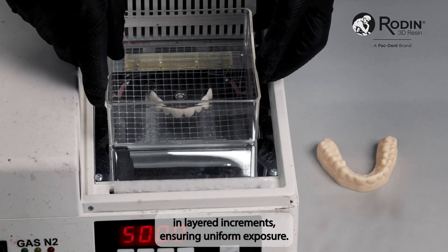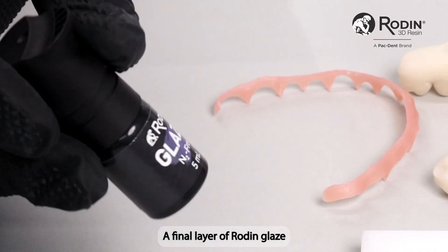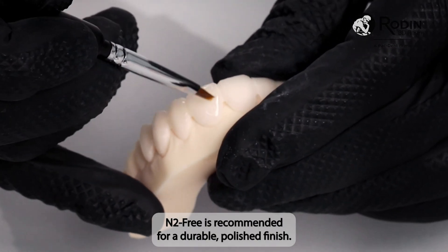Cure the veneer in layered increments, ensuring uniform exposure. A final layer of Rodin Glaze N2-Free is recommended for a durable, polished finish.